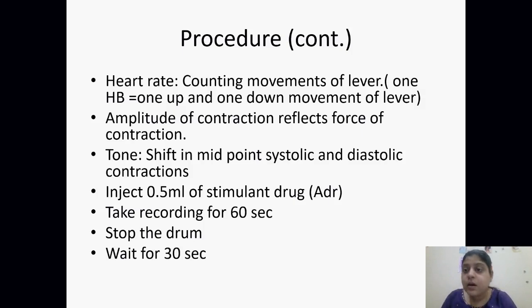Amplitude of the contraction will tell us about the force of contraction. Tonus is the shift of the midpoint of the systolic and diastolic contractions from the baseline; that will be the tone. And now we have to inject 0.5 ml of the stimulant drug adrenaline and take a recording for 60 seconds.